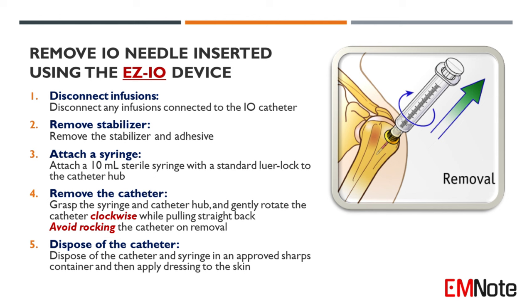Step 2: Remove the stabilizer and adhesive. Step 3: Attach a 10 mL sterile syringe with a standard luer lock to the catheter hub.